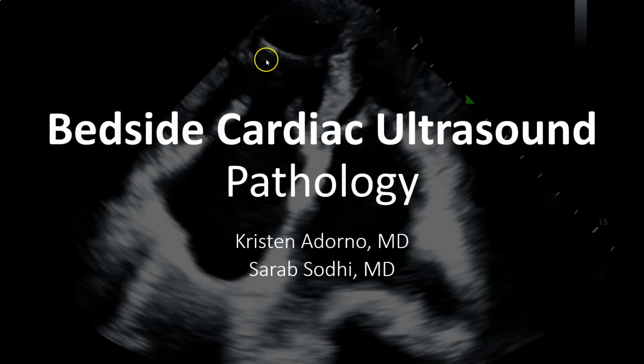Hi and welcome back. If you've watched the first video in the series, you've just covered a review of the basic views. As a reminder, we're now going to talk again about pathology. Specifically, we're going to aim to discuss what the abnormals are, what they should look like, and what we're looking for in those views. So let's get to it.